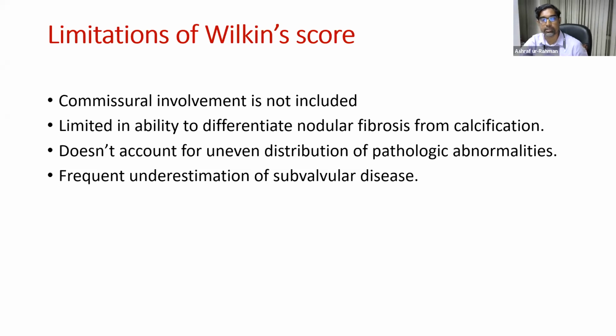And the limitations of the Wilkins score are that commissural involvement is not included here, there is an inability to differentiate nodular fibrosis from calcification, it doesn't account for uneven distribution of pathologic abnormalities, and it frequently underestimates subvalvular disease.